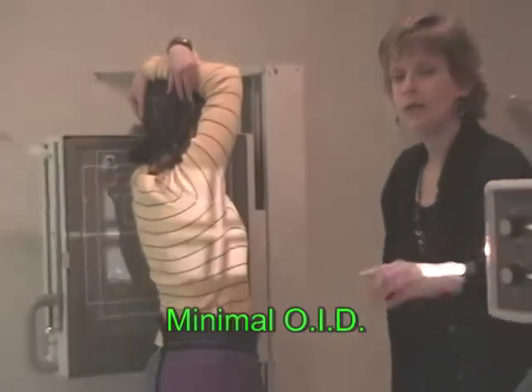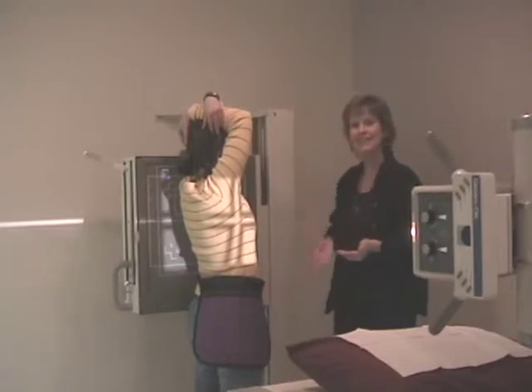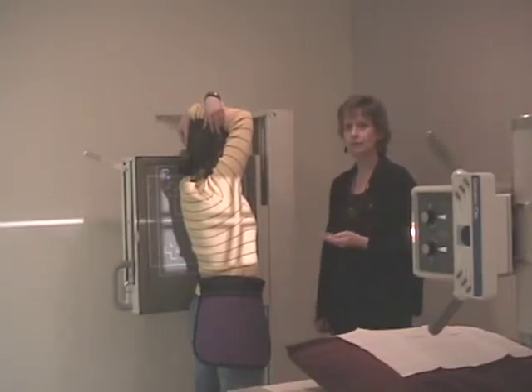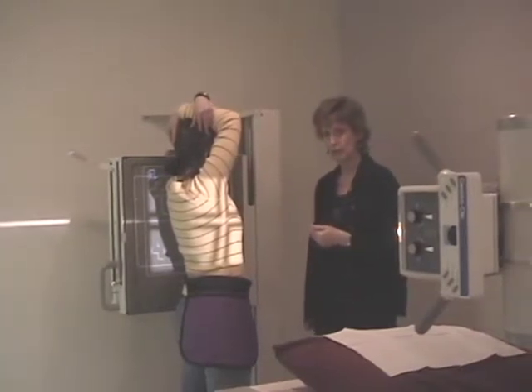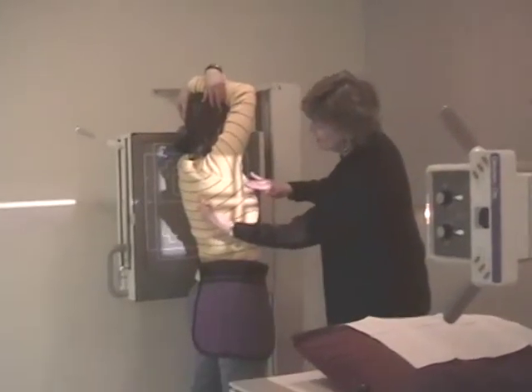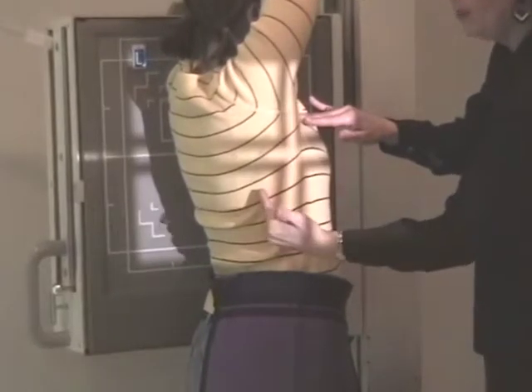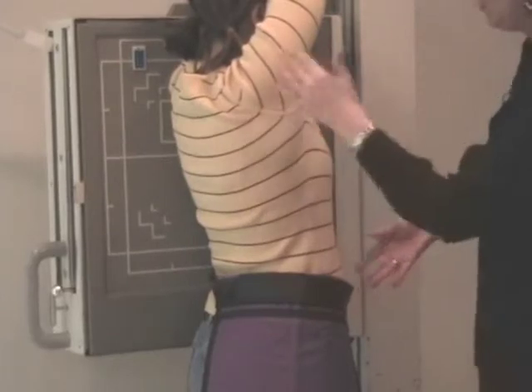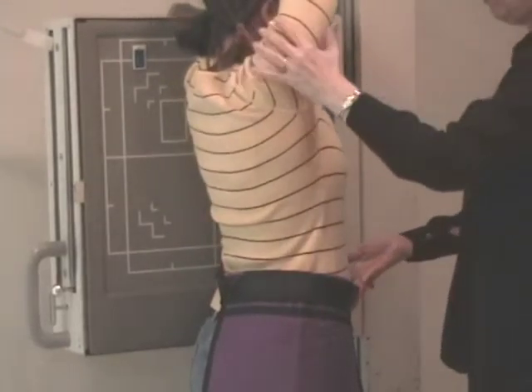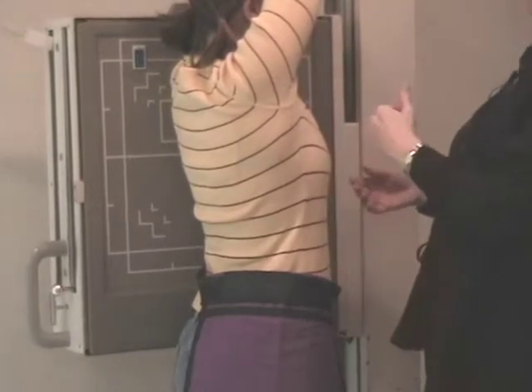Now height-wise, Drea has not grown in the last 4 minutes, so I do not need to change the height of the cassette. But the other centering reference point is not the mid-sagittal plane for lateral, it's the mid-coronal plane. Mid-coronal plane divides the front and back halves of the body right in half. And I'm going to be looking to have the mid-coronal plane to the center of the film. She's leaning back on me a little bit, so if I can prevent that, I'm going to. Notice I just got her a little straighter rather than the leaning back.